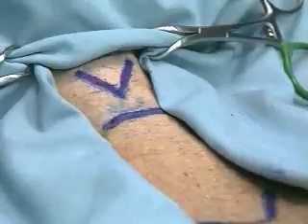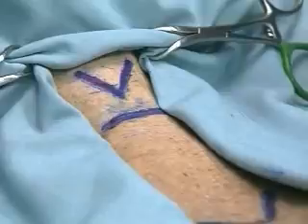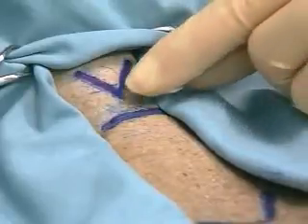The patient should be positioned supine with the neck in the neutral position. In trauma patients, care must be taken to maintain C-spine control. Sterile prep and drape the anterior neck if time permits. Palpate the cricothyroid membrane below the thyroid cartilage in the midline.